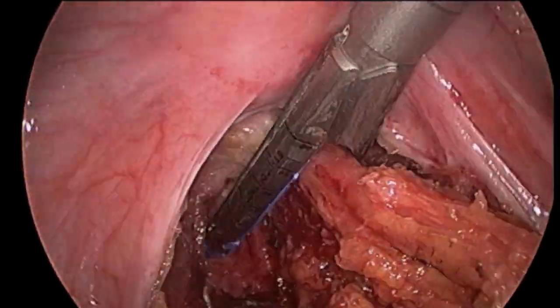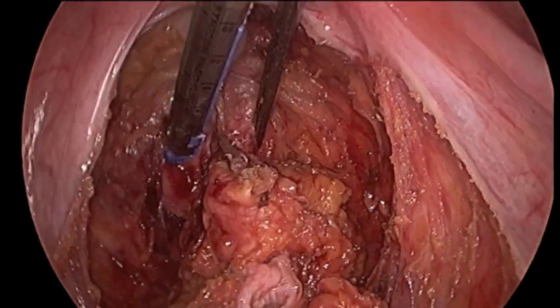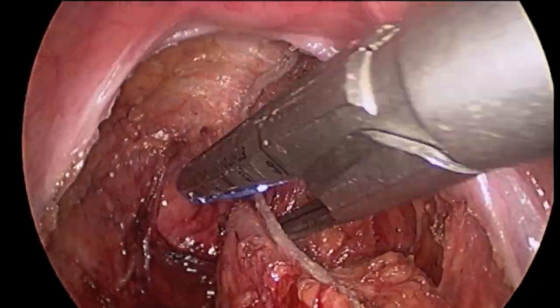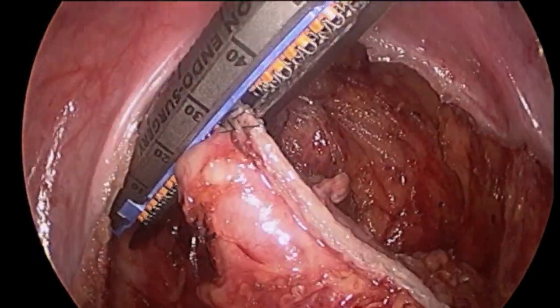This instrument fires six rows of titanium staples to seal both sides of the bowel, then divides the bowel with a steel blade between the middle rows. In this case, two applications of this 60-millimeter device are needed to completely divide the rectum.